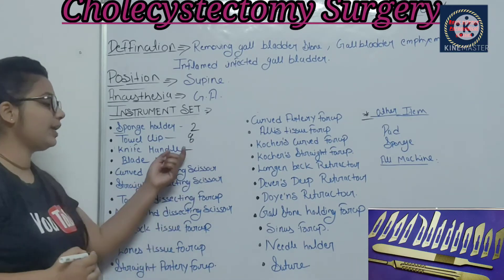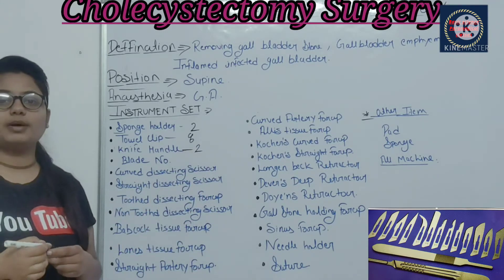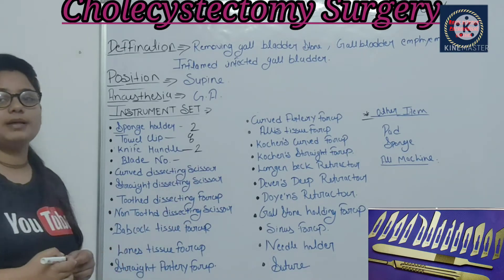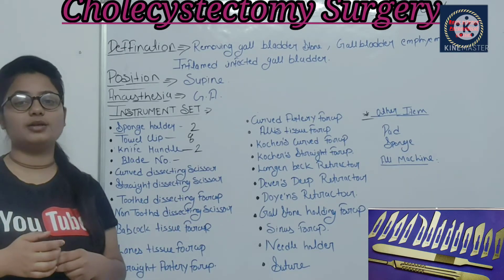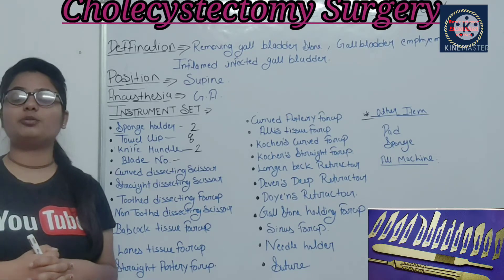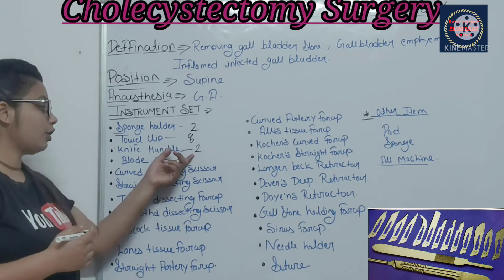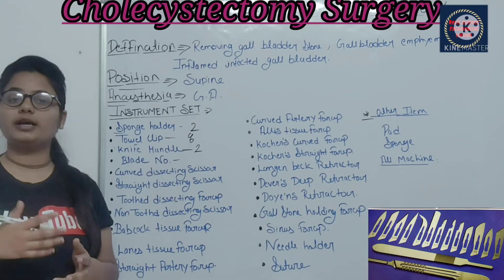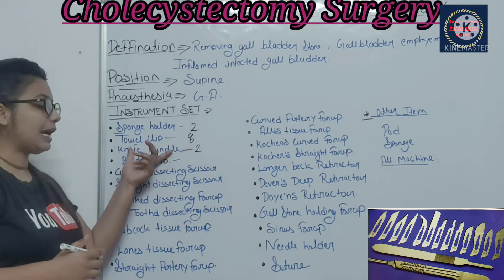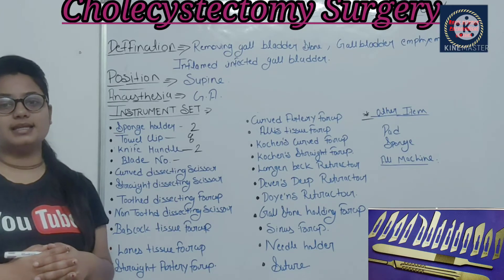Next is the knife handle. You need 2 knife handles — number 3 and number 4. The blade numbers are 11 and 15; you can also take 20 or 22. Remember: knife handle number 3 takes blades 11 or 15, while knife handle number 4 takes blades 20 to 25. The knife handle with blade is used to cut the patient's abdomen.